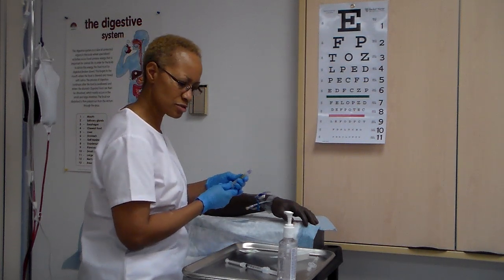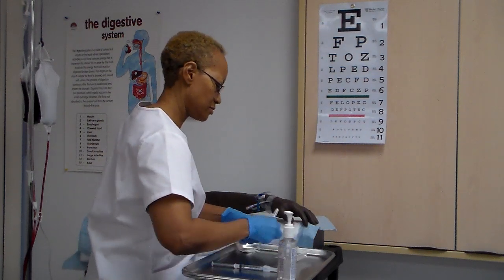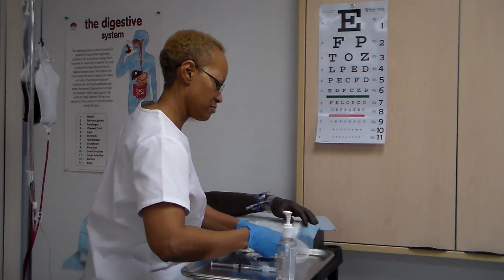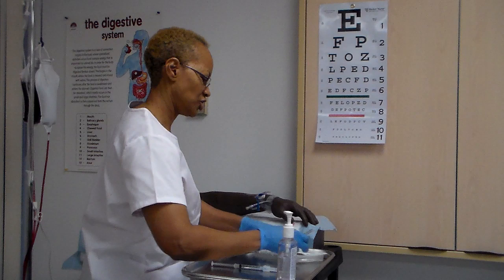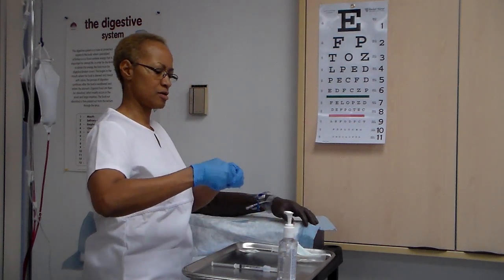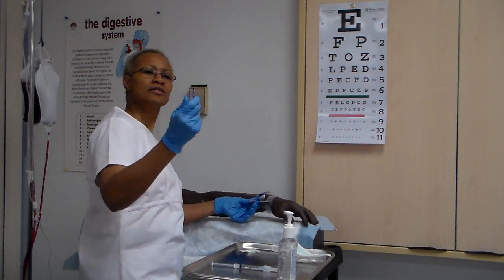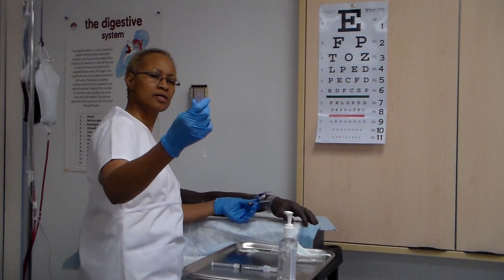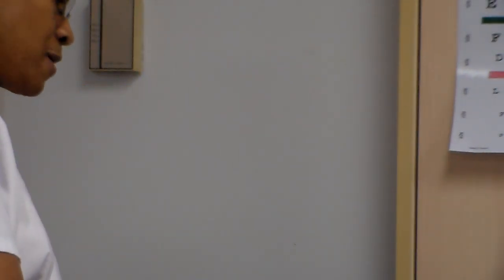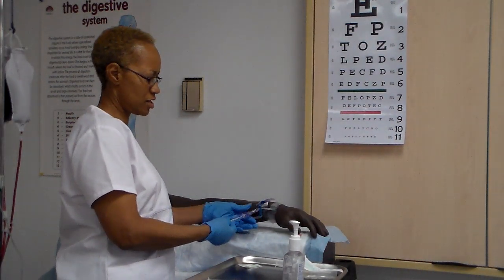It doesn't work with this syringe. Okay, let's switch so you can see how it works. Let me show you how it works. Okay, needleless again. See the little clamp? You'll pinch it. You see? Okay. So you pinch it, slide it into the center, and it actually snaps on.